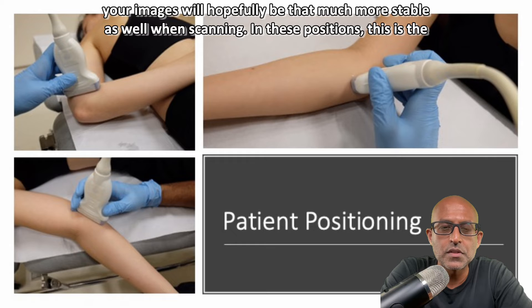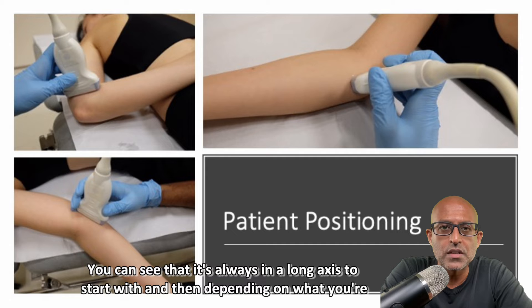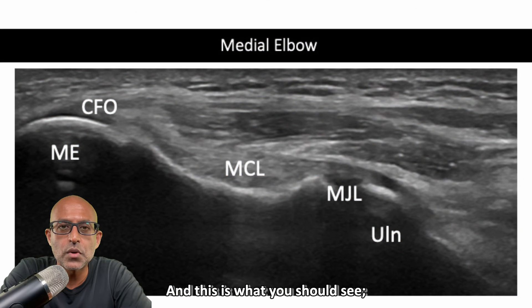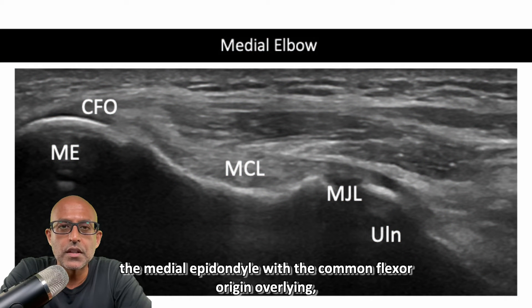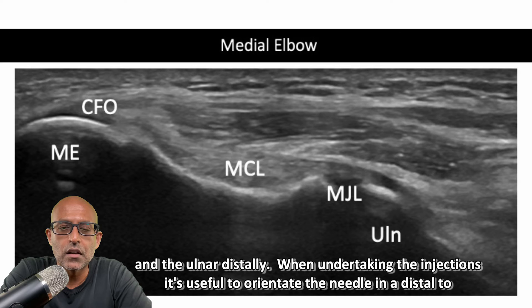When scanning in these positions, this is the orientation of your transducer. You can see that it's always in a long axis to start with, and then depending on what you're scanning for, you may adjust it accordingly. And this is what you should see: the medial epicondyle with the common flexor origin overlying, the medial joint line with the medial collateral ligament overlying, and the ulna distally.